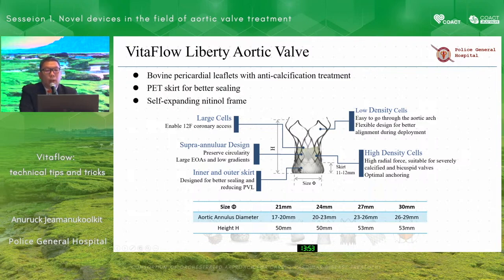It seems the skirt is not sutured very tightly. It can be bulky when you put vertical force on the valve. It will be bulky because it is loose tissue around the skirt, and blood can come through the hole here because the suture is not closed, allowing blood in diastole to come inside.